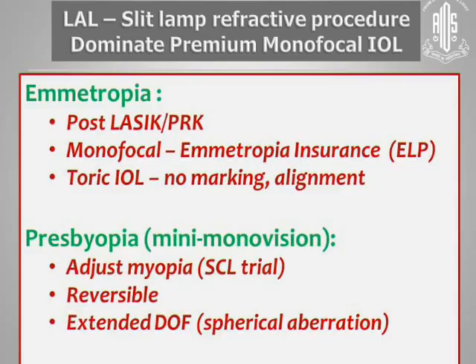So I was asked to talk about the future. We know that this is the way to go for a LASIK eye. You're going to be able to adjust the refraction. It's like doing LASIK on the IOL. For anyone who wants to see well in the distance, they don't care about reading, we're about within half a diopter or better, 75%, the best. That means you have a 25% chance you're not going to be within a half diopter of emmetropia. This will be an insurance policy.